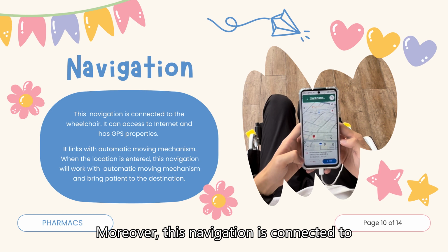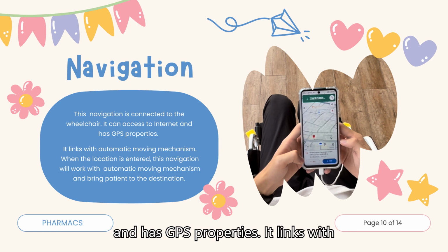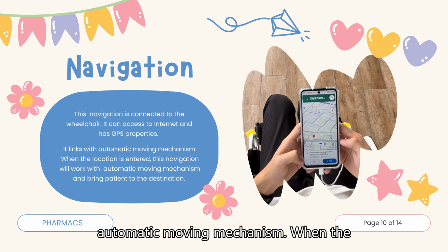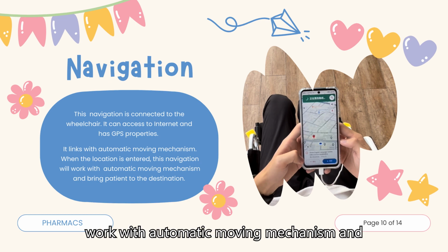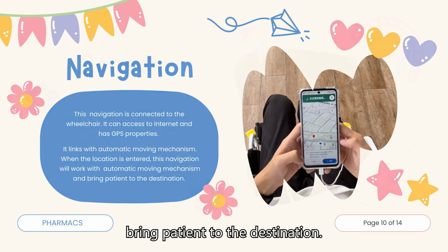Moreover, this navigation is connected to the wheelchair. It can access the internet and has GPS properties. It links with the automatic moving mechanism. When the location is entered, this navigation will work with the automatic moving mechanism and bring the patient to the destination.